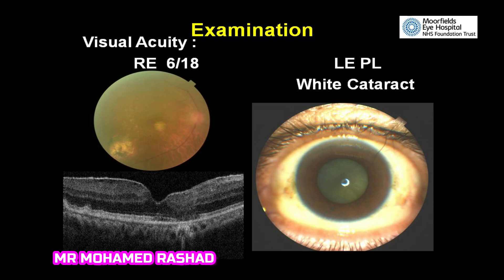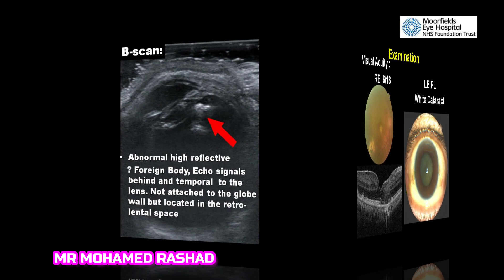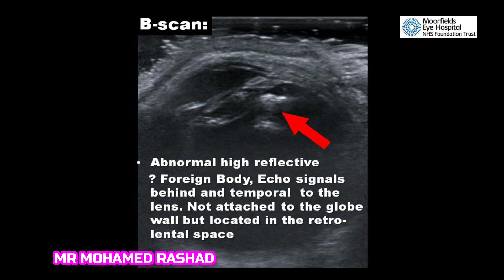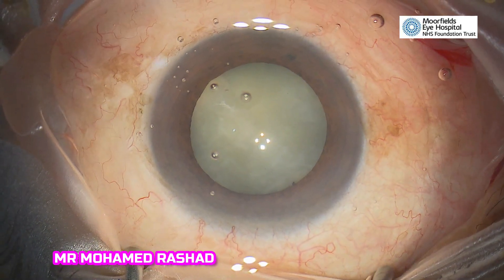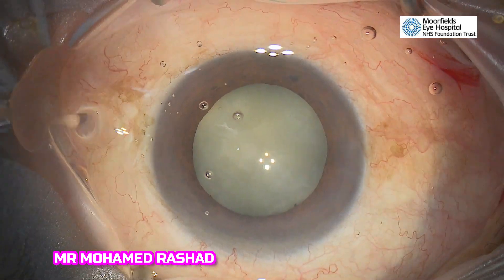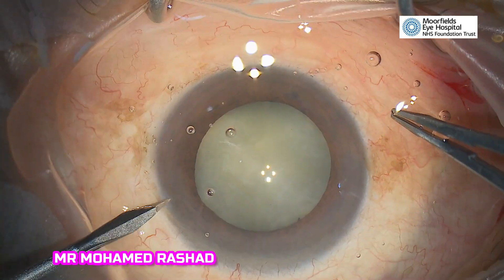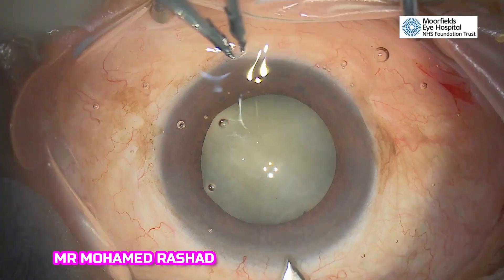On examination, the right eye is 6 over 18 with some outer retinal changes and scarring. B-scan showing an abnormal high-reflective foreign body in the vitreous cavity, so we decided to start surgery and explore what this foreign body is behind the lens.